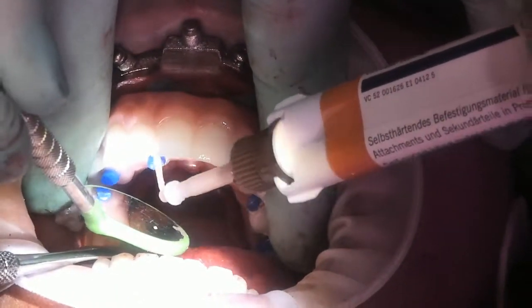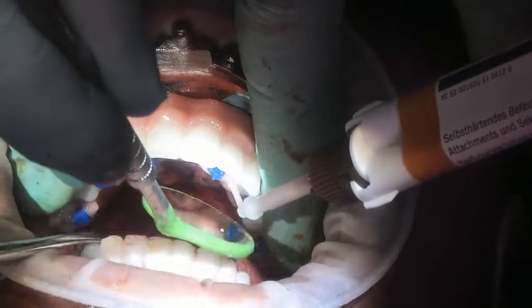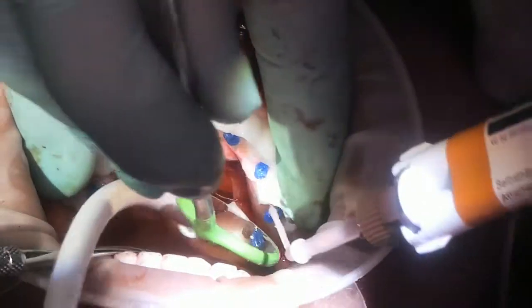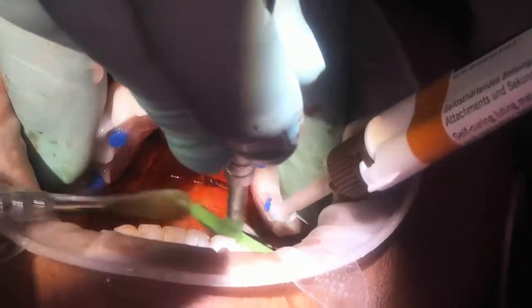The Voco that we send is a self-cure. It is not a light or dual cure. It takes about 120 seconds. And each site is backfilled until the prosthetic is connected to the temporary cylinder. And that is the pickup process.